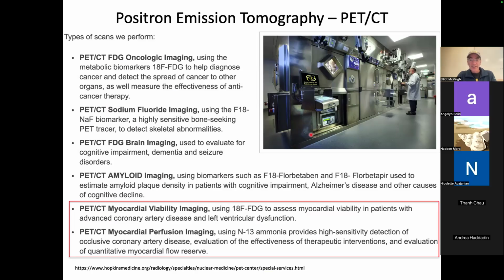The unfortunate thing about PET is that you buy the scanner and it looks like that scanner that we saw in the picture. It just looks like an MRI scanner or any other old scanner. Unfortunately, with PET, you also have to buy this thing, right? And this is like a particle accelerator in order to bombard various nuclei, usually with protons, in order to create the radionuclides that have a nucleus that is one of these atoms.